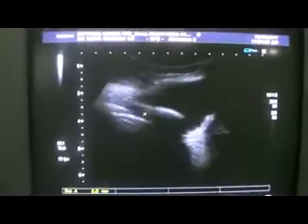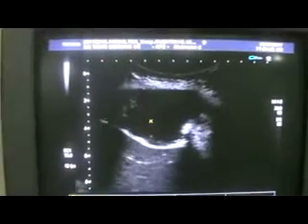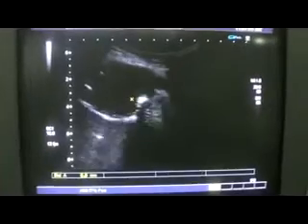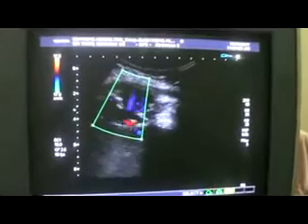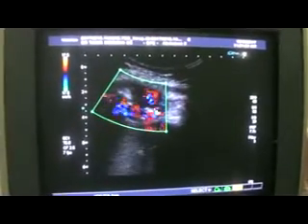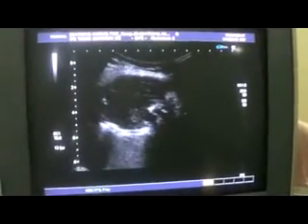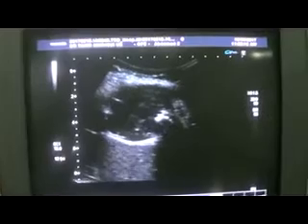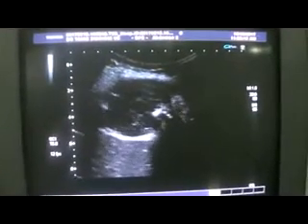Anterior to the liver, and I can see it in the patient in lateral decubitus posture. Now just to show you the color Doppler — you can see it is not moving with the liver. So this is a subcutaneous collection just below the skin, above the liver, and it is not relating to the liver.